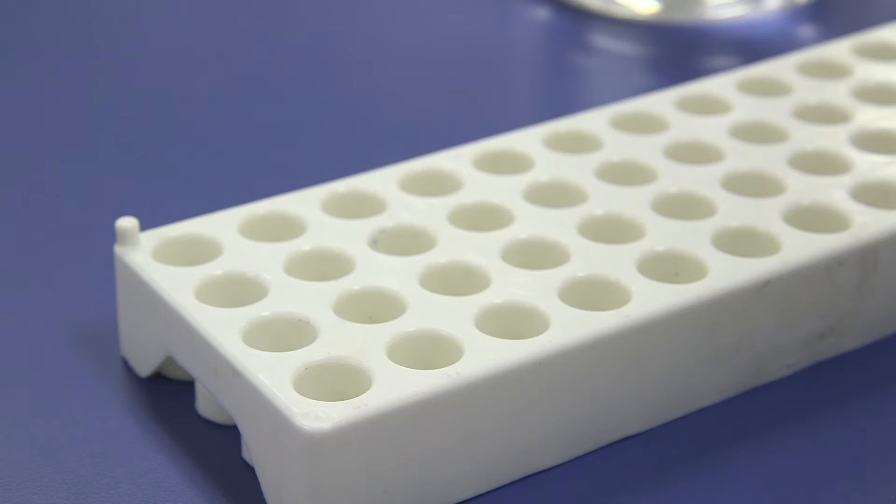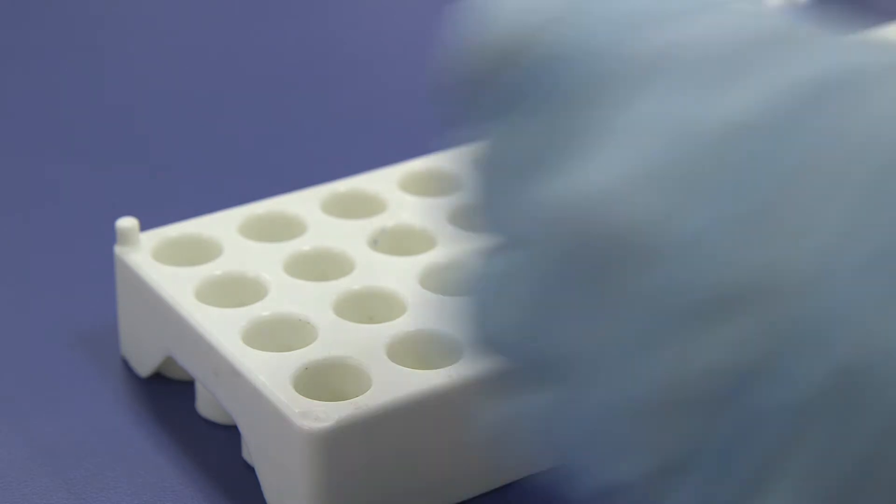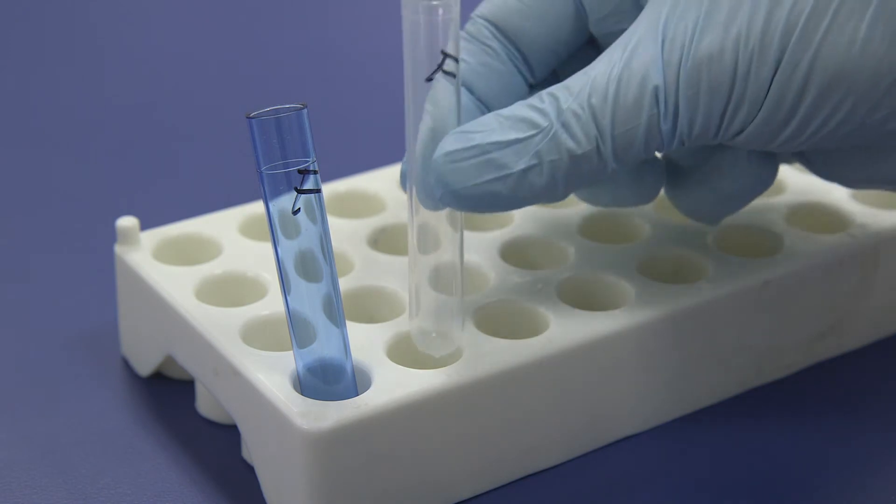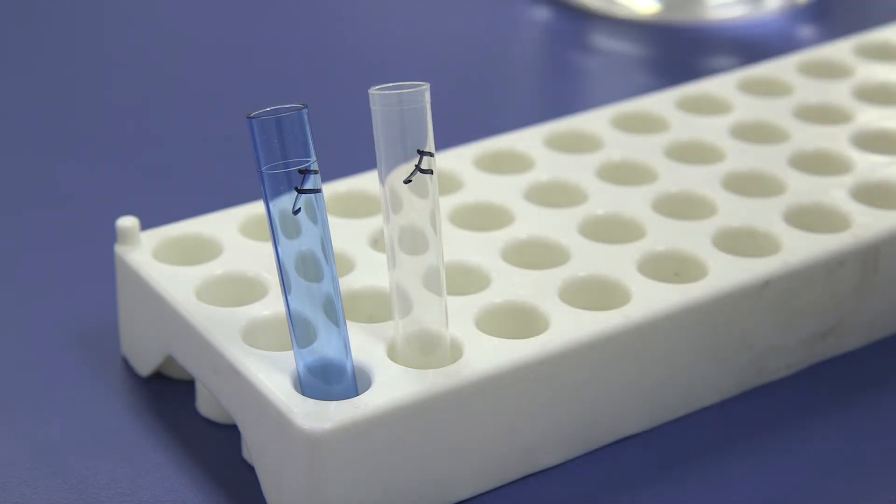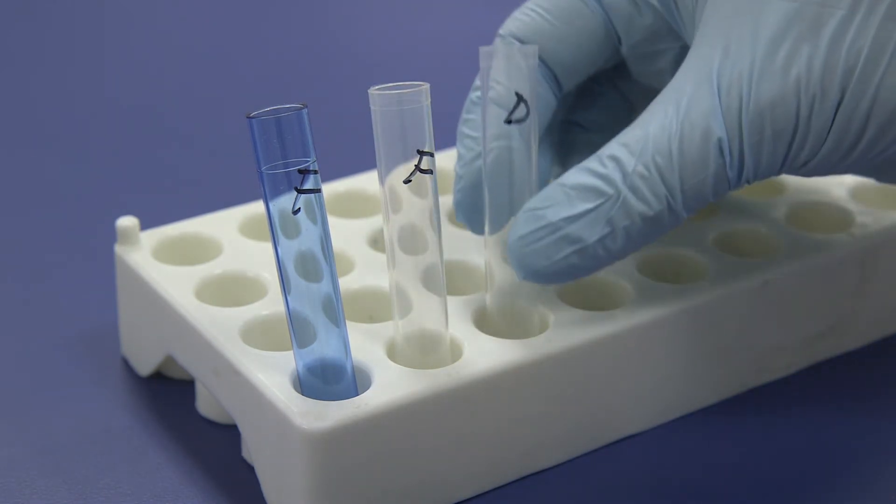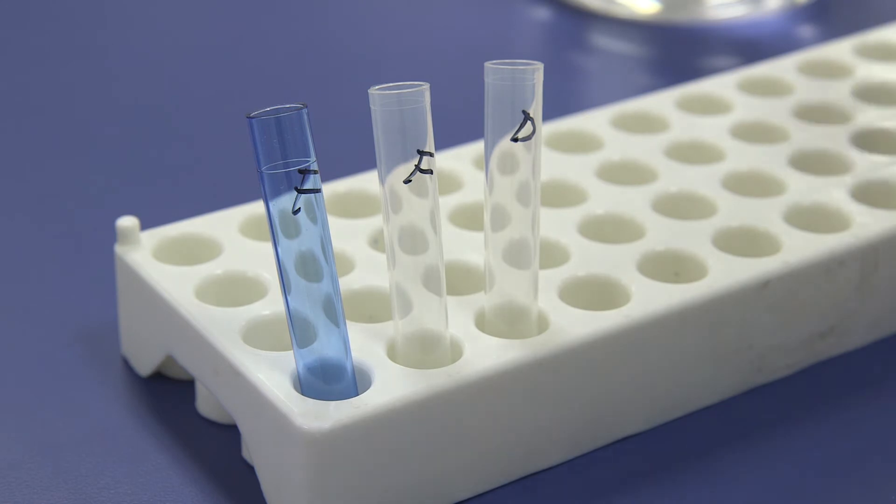To optimize your workflow, we recommend labeling tubes as follows when testing for all three mycotoxins. Label a blue dilution tube with F for Fumonisin. Label three clear reaction tubes: F for Fumonisin, D for DON, and A for Aflatoxin.